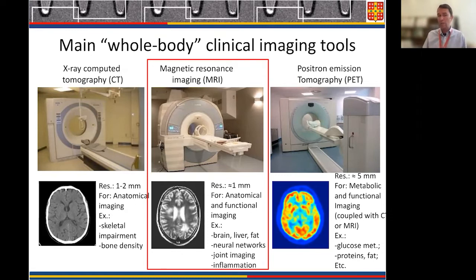But look at the images. On the left side, CT image, X-rays are projected through the patient, and what you see is a 3D reconstruction, like a radiography. Bone and calcium-containing materials attenuate X-rays much more, so you have a lot of attenuation in the skull, but not a lot in the brain. So the differences of contrast in the brain are not very good.